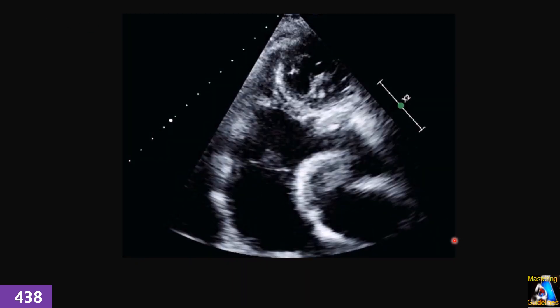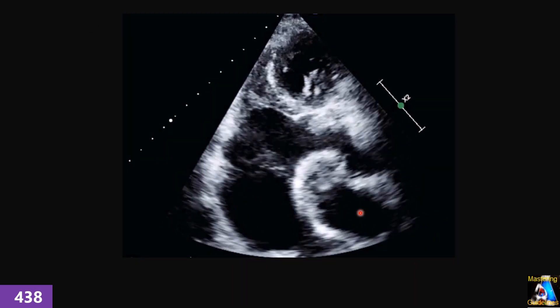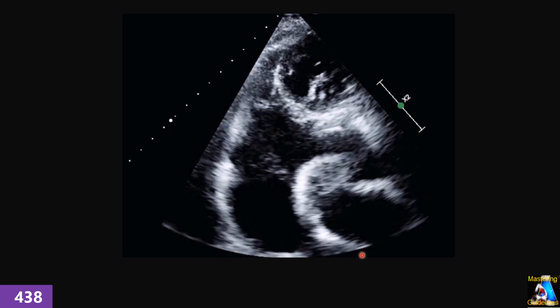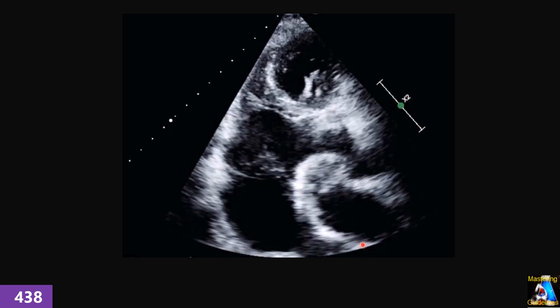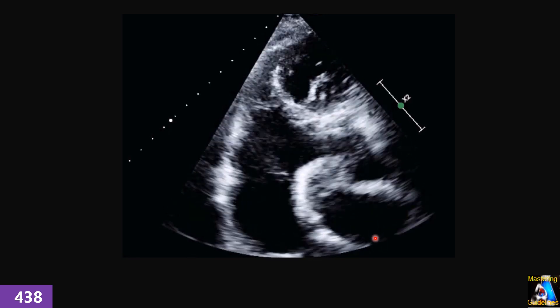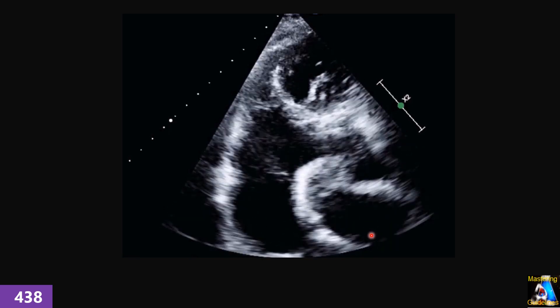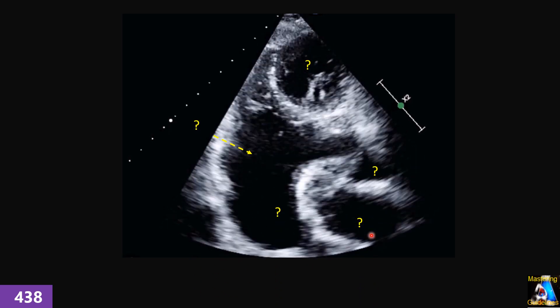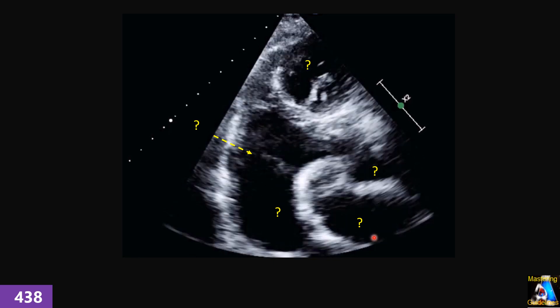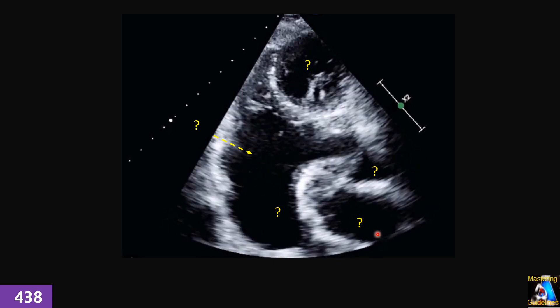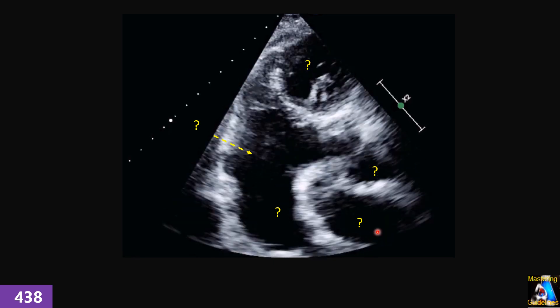Here we have another apical view. What view is this? When do we use this view? And what are those structures — can you name them?